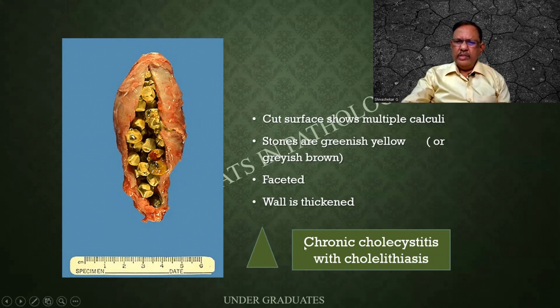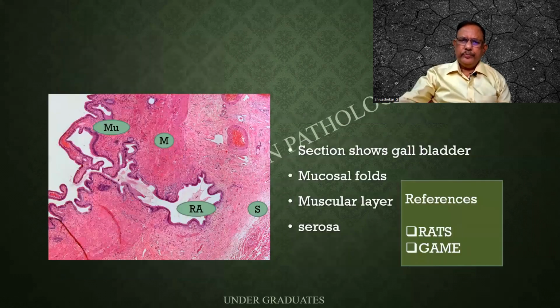So the diagnosis is clear. It is a case of chronic cholecystitis with cholelithiasis. For gross, we must mention only the gross features. That having been said, we'll go to the next slide.